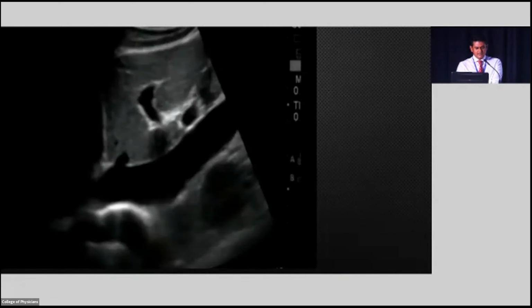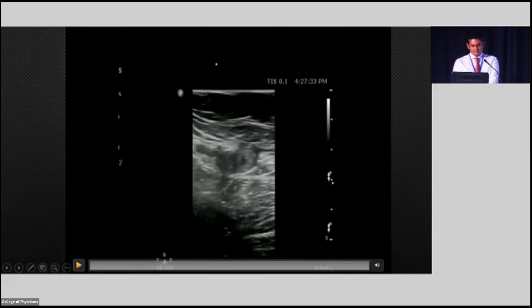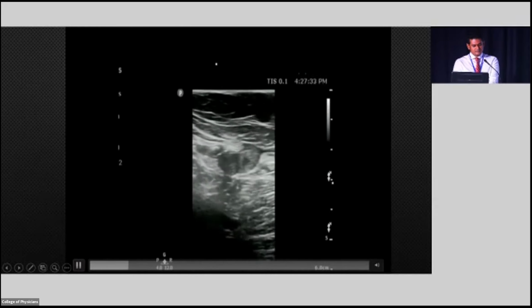Further, we assessed the IVC, which is plethoric and non-collapsing. So with the given clinical picture, dilated RV, pressure overload, dilated IVC, in a patient with hypotension who has had a prolonged stay, especially immobilized, it's very likely this is going to be a massive pulmonary embolism. And we further scanned the deep veins. This is the femoral vein and the femoral artery. You see a large clot in the femoral vein. So you know the source also.